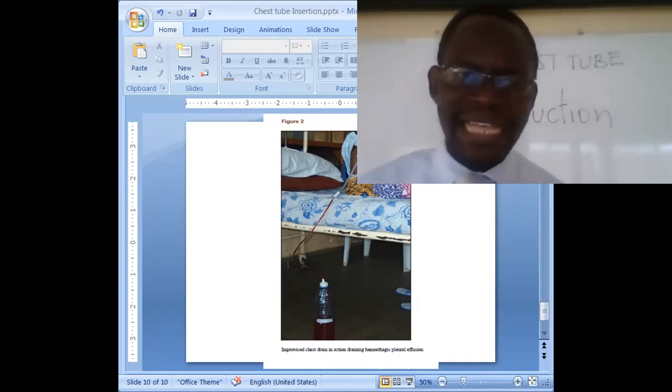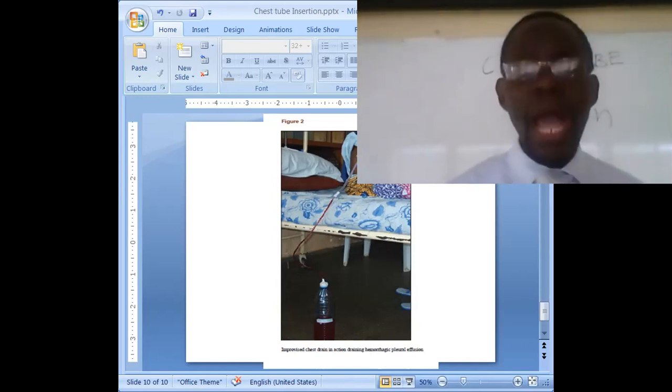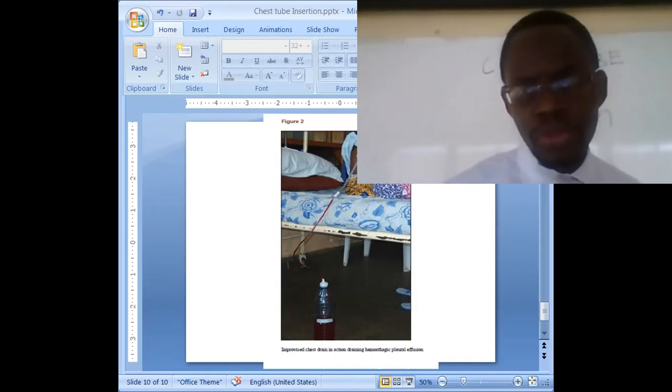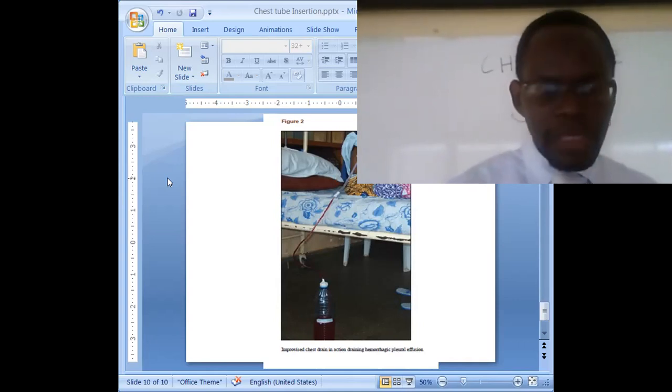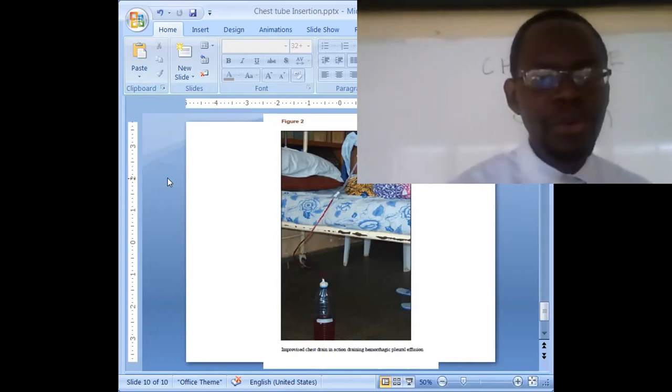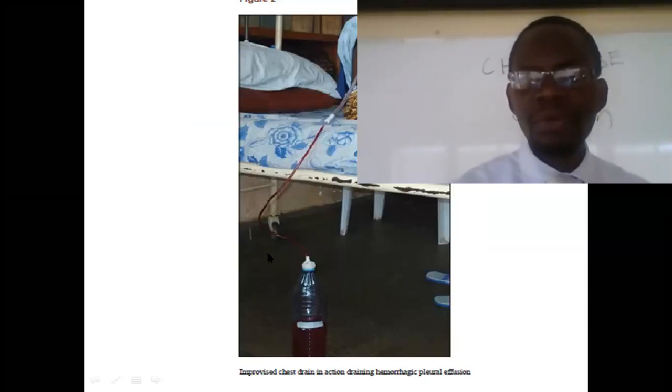That can act as an improvisation, and it has been shown to work. However, it is not as efficient as the water seal chamber that we know.